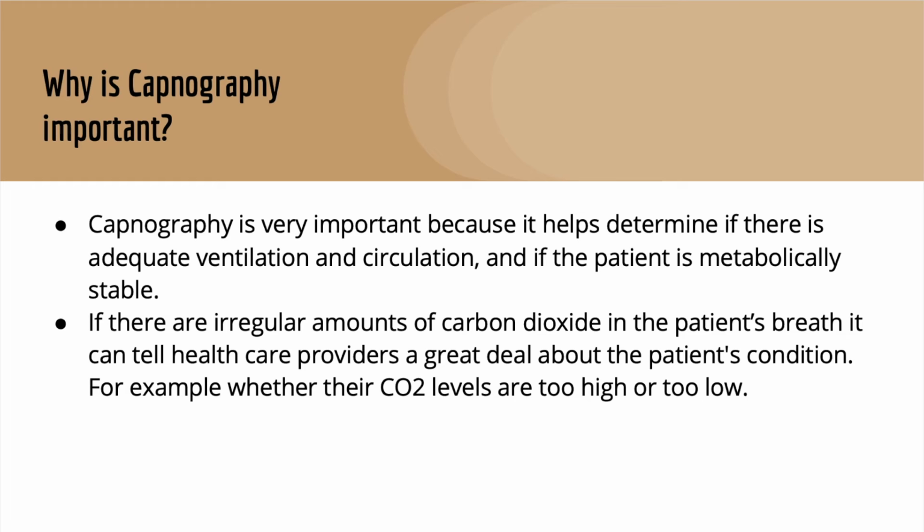Patients who have seizures are often confounding. Capnography can readily determine if a seizing patient is apneic or breathing while they are seizing, and also whether their breathing is effective or ineffective. So it's a very important tool to use, and there's no reason we shouldn't use it, because once again, it is non-invasive, and it seems like a little thing, but it can determine a lot.